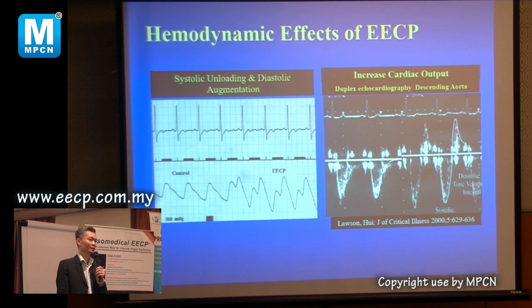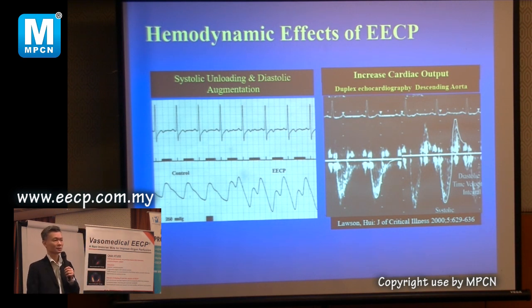So I recommend it to patients who are unable or don't want to do an operation, because of this study. The nuclear scan is our gold standard. They can change their prognosis. If we can reduce ischemia, that means they can live longer. That is the one that convinced me that this thing may work.